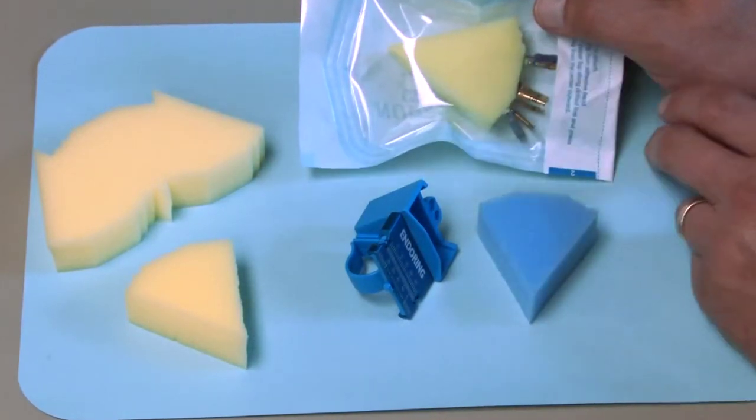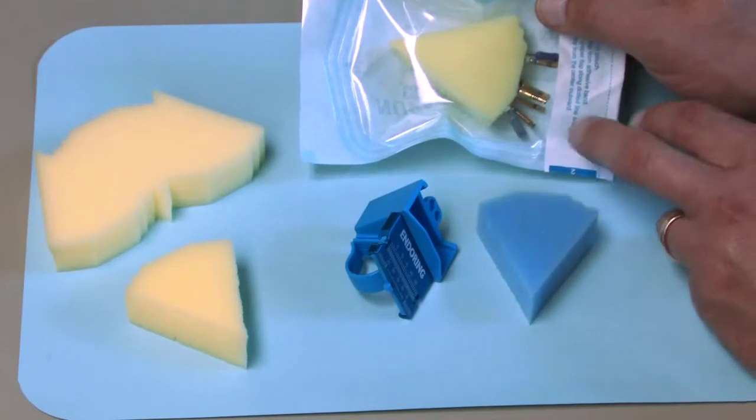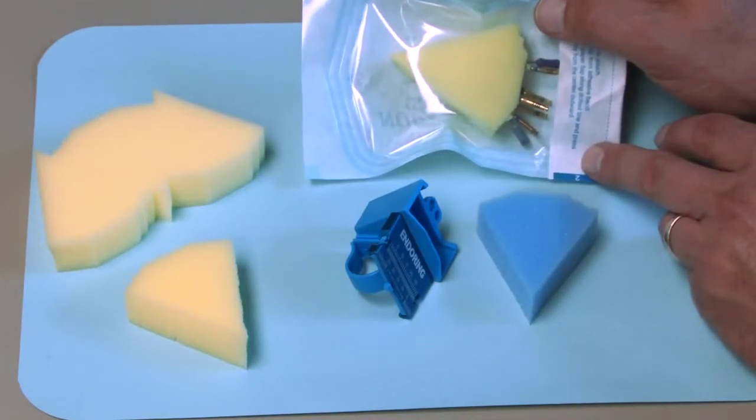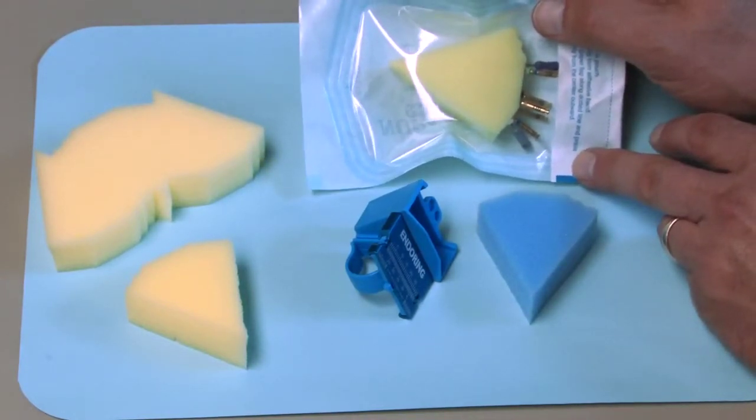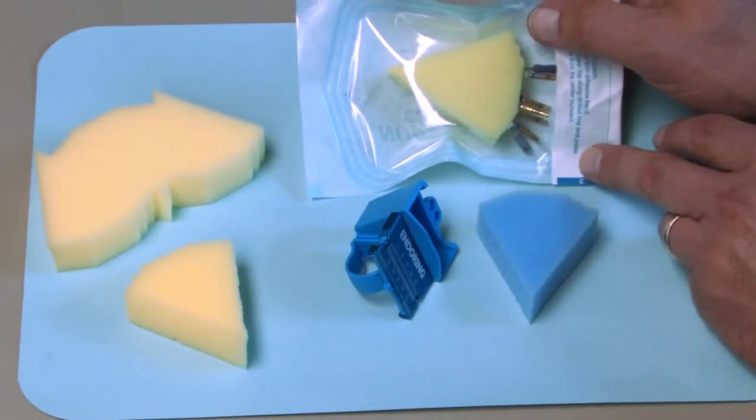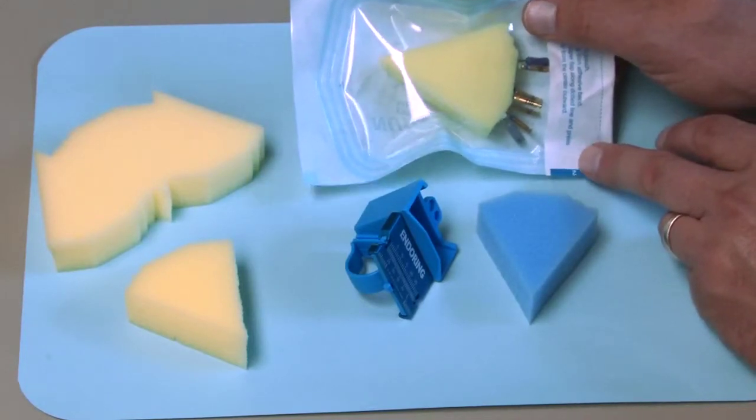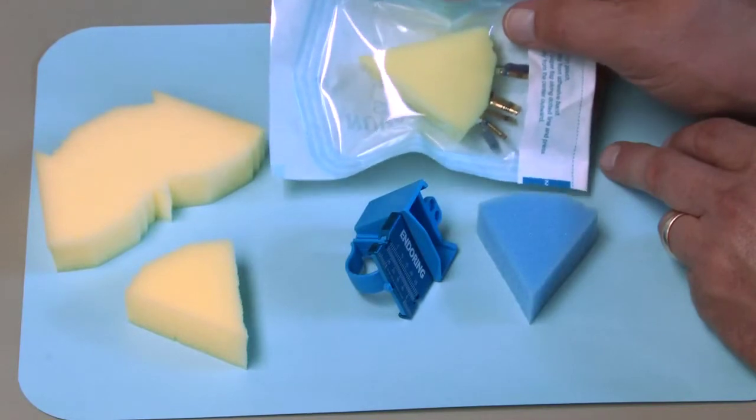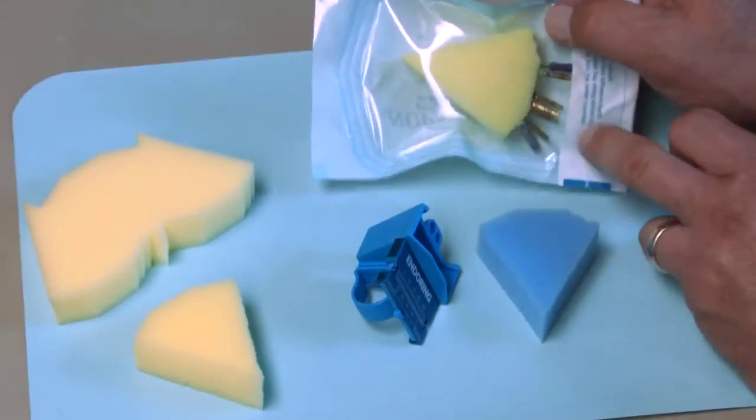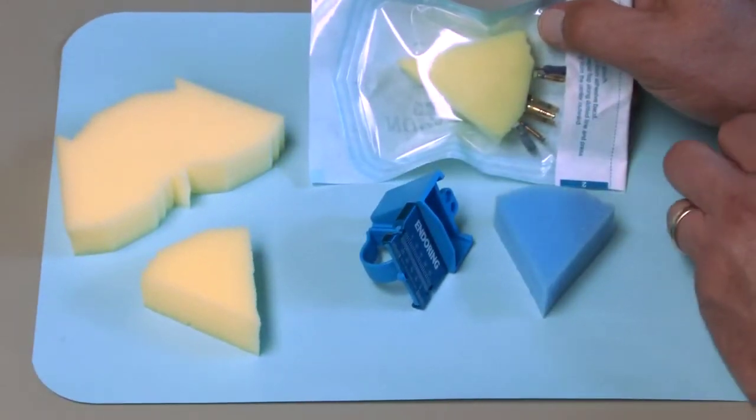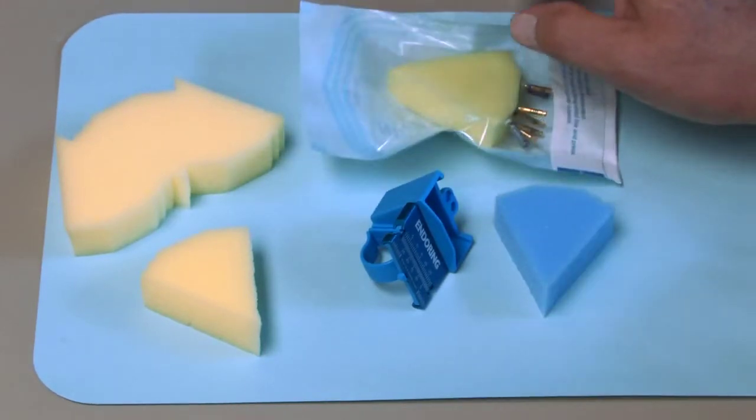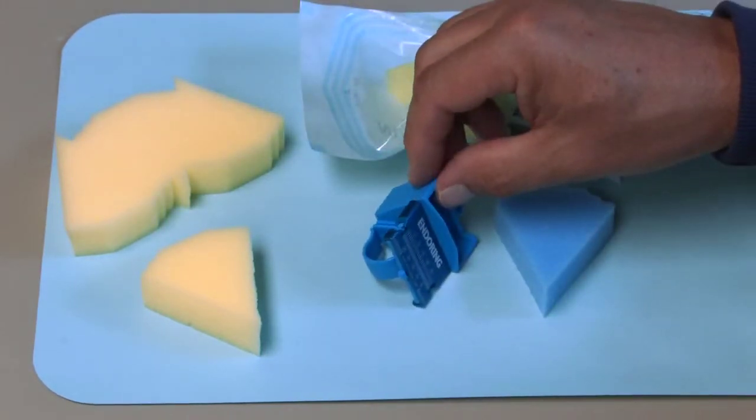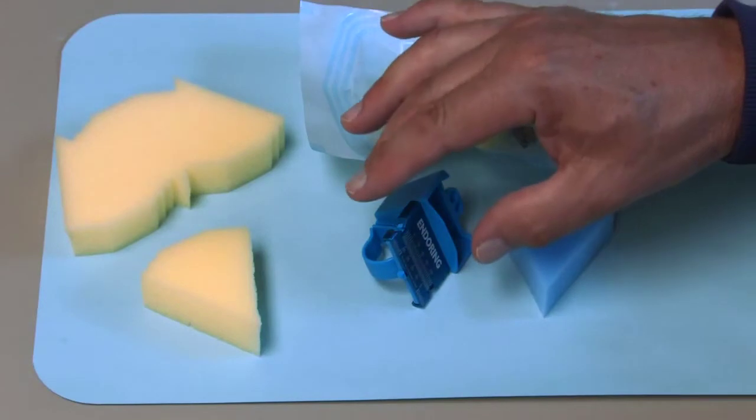We also recommend that you take clean files before a procedure, load them into the Jordco foam insert, then place them in a clear autoclave bag and process them. It is very important that you never use a Jordco foam insert more than once. Once you have processed the foam and the components, they can be delivered to the assistant or the doctor's work area fully processed and ready.